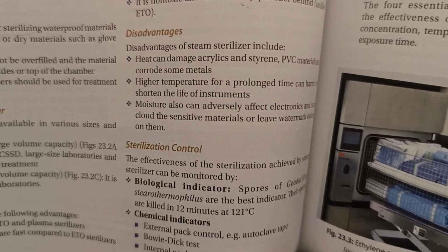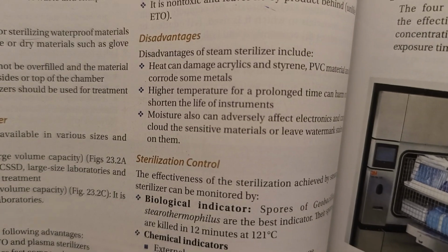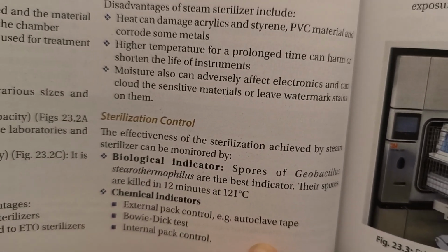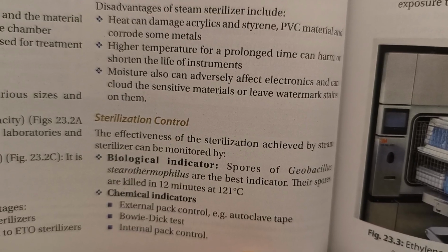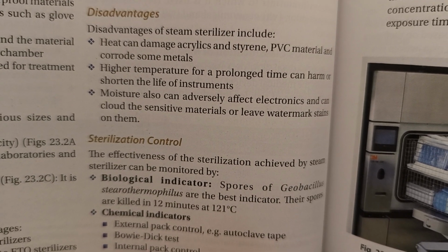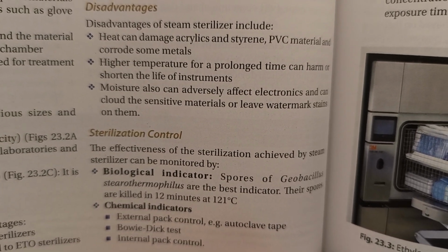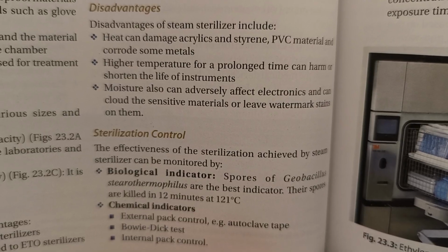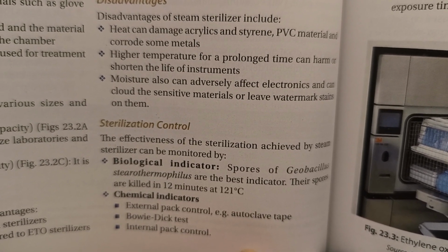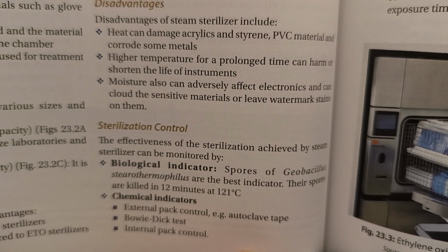Sterilization control. The effectiveness of the sterilization achieved by steam sterilization can be monitored by biological indicators. This is often asked in MCQs: spores of Geobacillus stearothermophilus are the best indicators. The spores are killed in 12 minutes at 121 degrees Celsius.